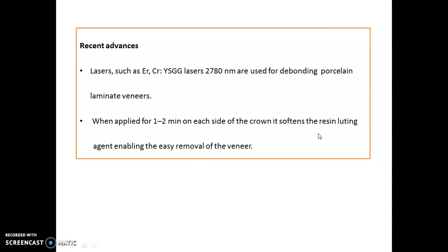So aspirants, this was all about the different methods of your crown and bridge removal, and also we have seen the most common causes, that is bad treatment planning in crown failure.